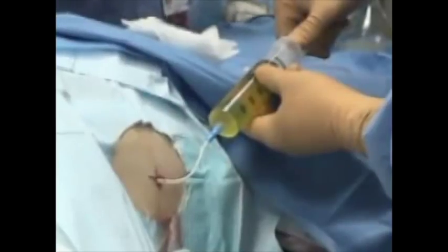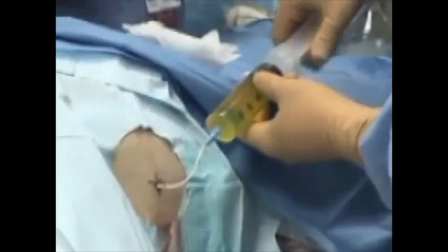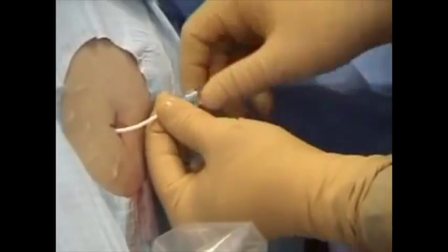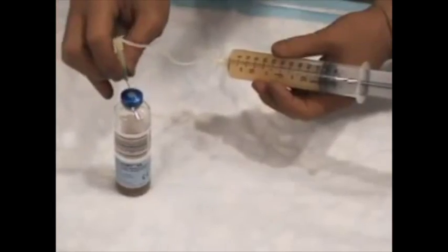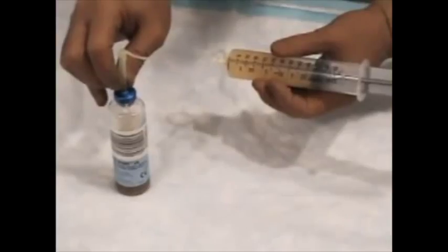If a diagnostic sample is required, attach a large syringe to the catheter and aspirate 30 to 60 milliliters of fluid for analysis. For therapeutic large volume paracentesis, attach the high-pressure tubing to the end of the catheter and then to an evacuated container. Blood culture bottles should be inoculated at the bedside using aseptic technique if spontaneous bacterial peritonitis or other infection is a diagnostic concern.